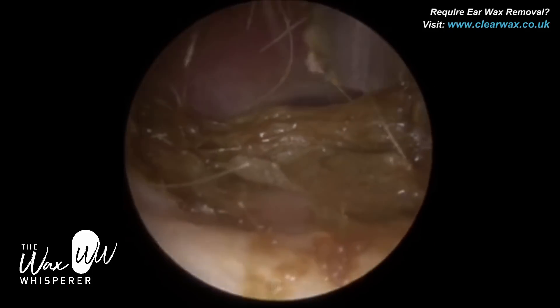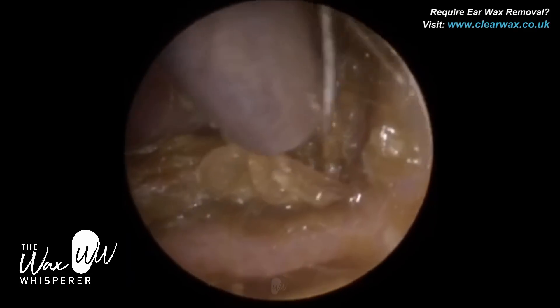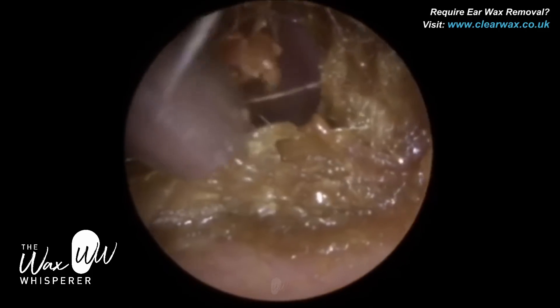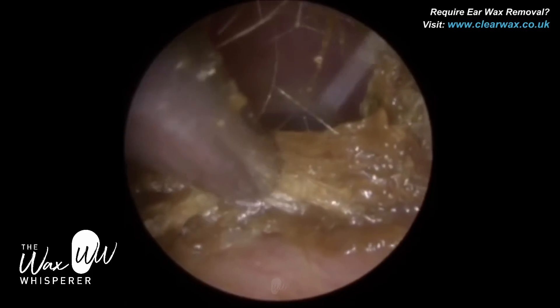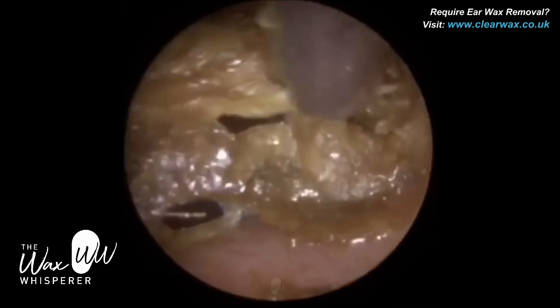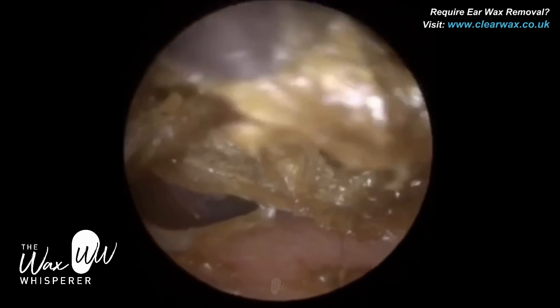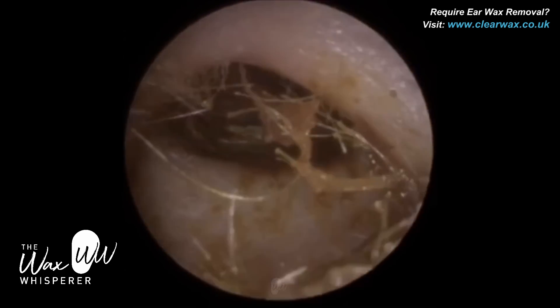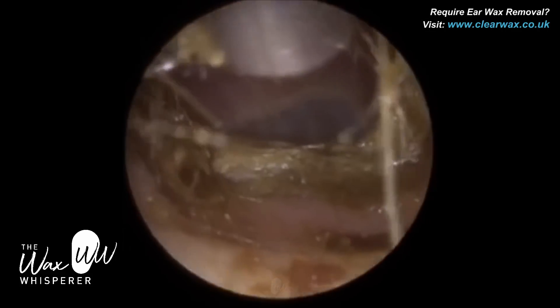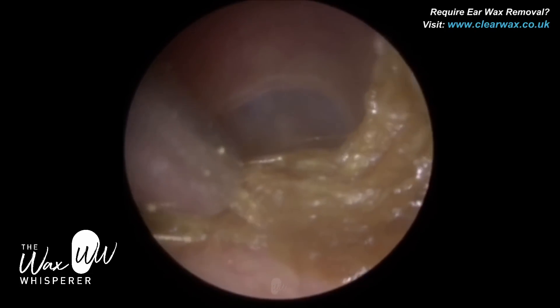The patient had been using hydrogen peroxide drops. Hydrogen peroxide drops, I find, does turn wax into a mashed potato consistency — it's not a consistency of wax that I particularly enjoy removing. It can be difficult to perform microsuction as it can block the suction probe. At times, if it's too mushy, I introduce some olive oil ear wax drops, which changes the consistency of the wax and binds it together, lubricates the plug of wax, and it just makes performing suction far easier.